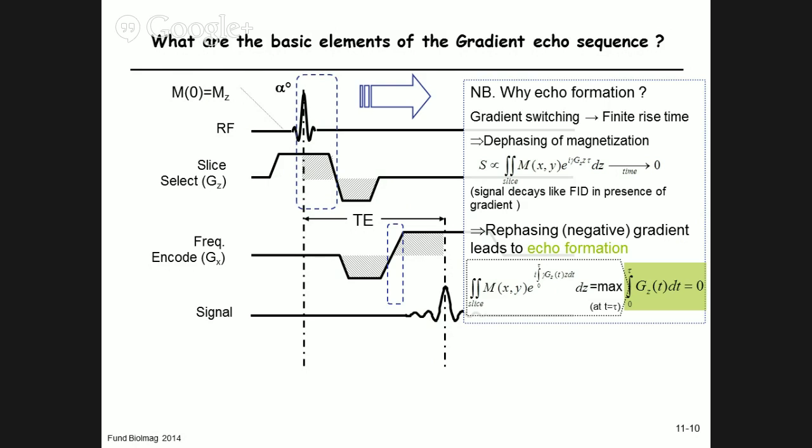Okay, that's the mathematical rehash of saying that this area, which is positive, has to be equal to this area, negative. Then you just integrate over time, so the integral from here to here has to be 0. What's behind it in all generality is this integral condition. Then the phase term here will become 0, so we have a spatially independent phase of the signal.